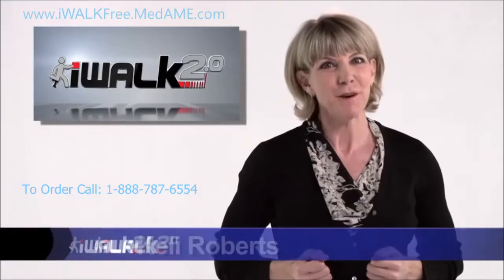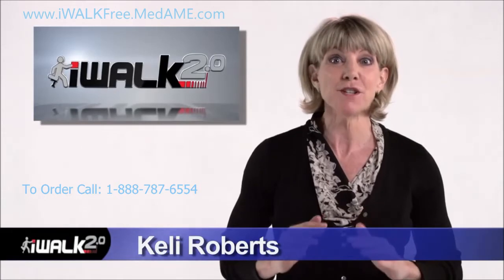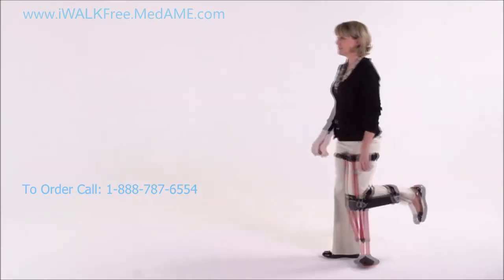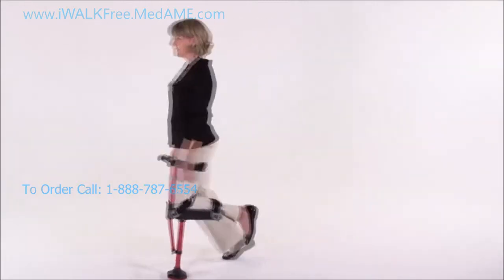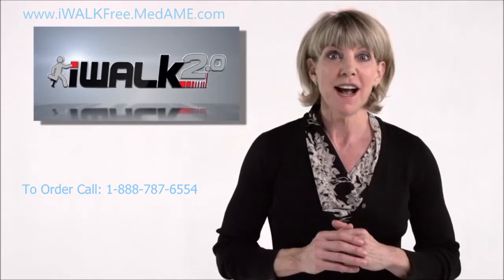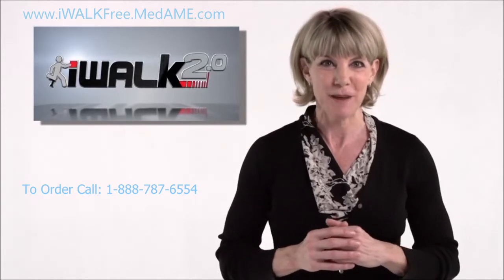I'm Kelly Roberts and I'm going to show you how to adjust and tailor your iWalk 2.0 so that walking for your first time will be safe and easy. We'll go through setting the height, vertical alignment, and adjusting and tensioning the straps.